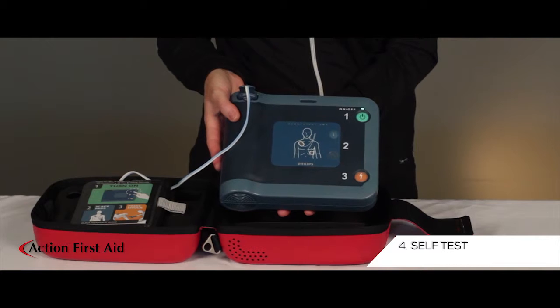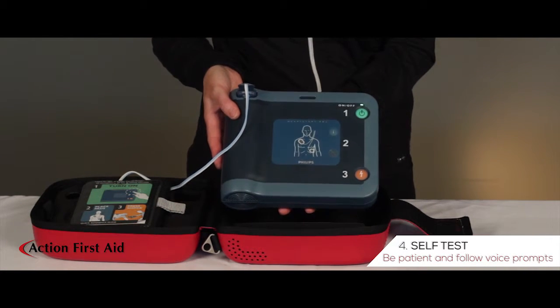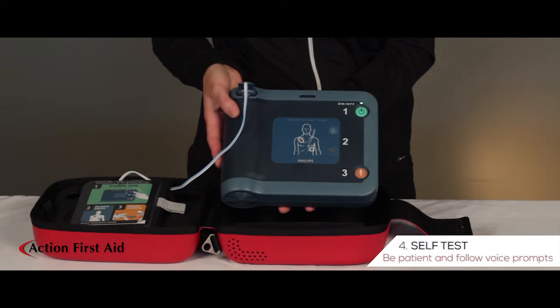Beginning self-test. If this is an emergency, press the green on-off button. Allow the machine to run through its self-test and follow voice prompts.